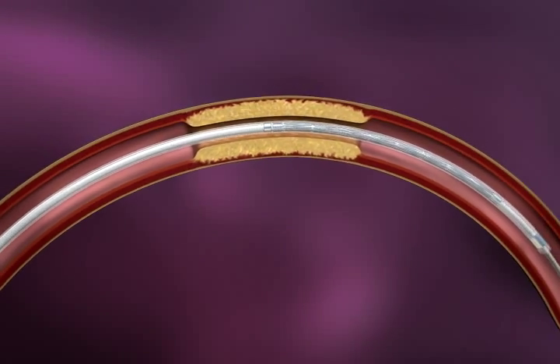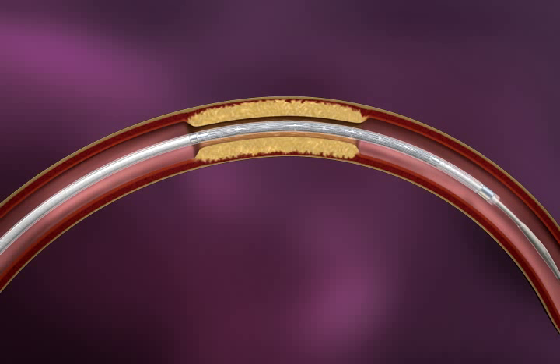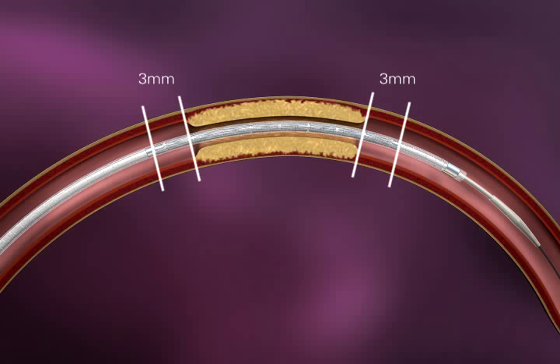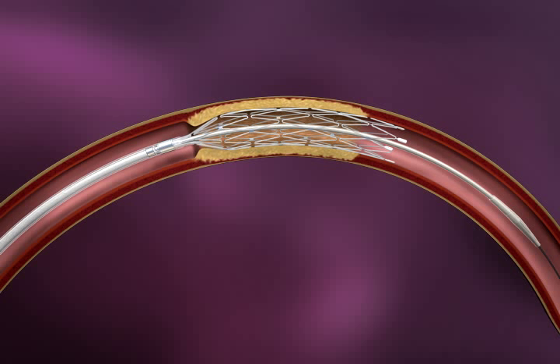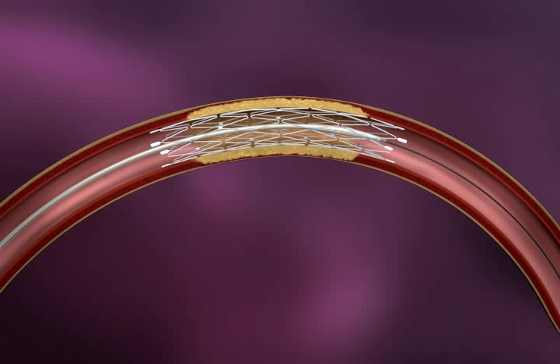Slightly withdraw the delivery system until the stent is directly aligned with the lesion. The stent should extend approximately 3 mm over each side of the lesion. The stent is now ready to deploy. To deploy the stent, the inner body should be held stationary with one hand while the other hand withdraws the outer body. This results in an unsheathing of the stent. Once the stent is fully deployed, the delivery system is removed.